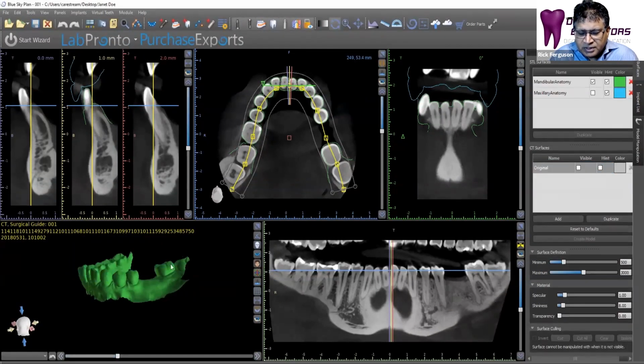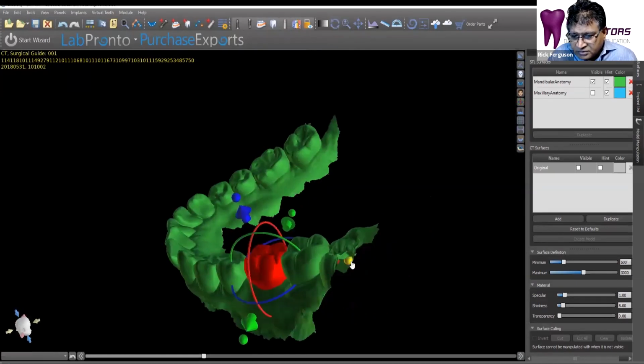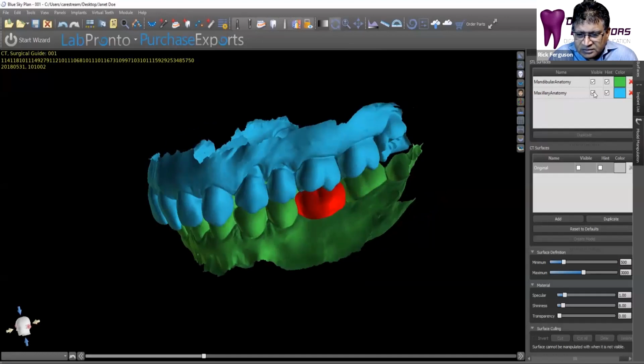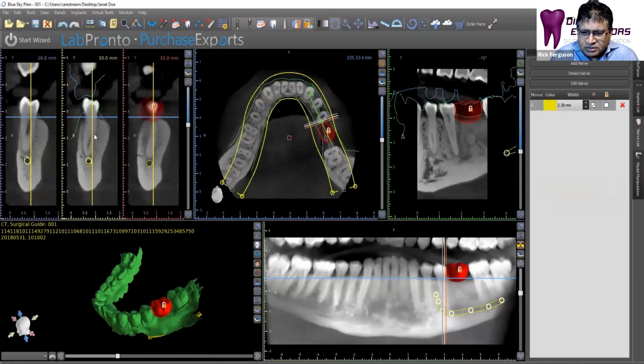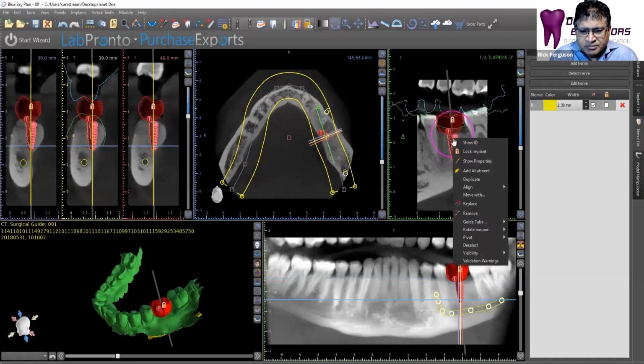You're going to do a digital wax up, which is typically what we're doing. Even for a single tooth case, we'll typically do a digital wax up because it's just so quick and easy to do. What you're seeing here is a video that I made. It took me about 8 minutes to do the entire process, and I sped up the video here to a little over a minute.